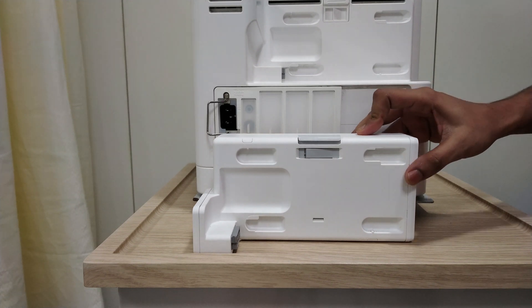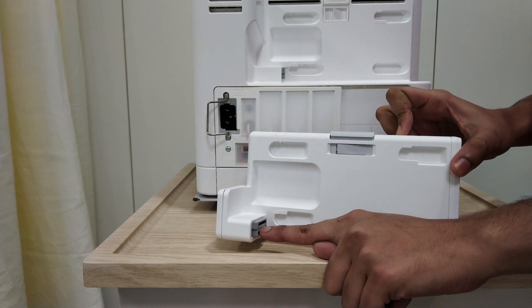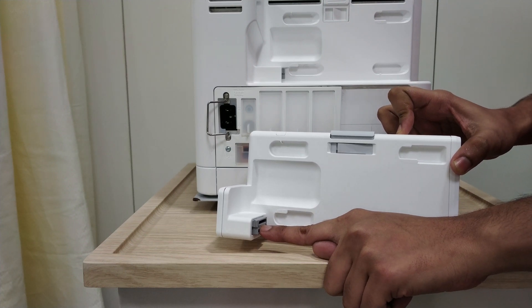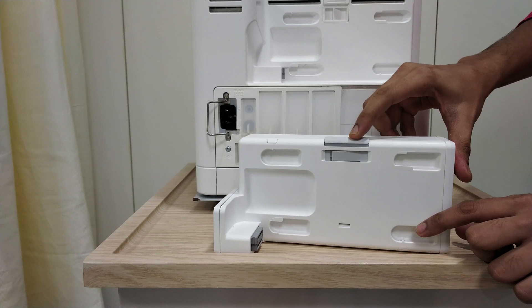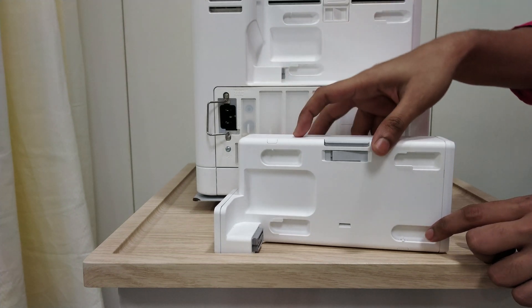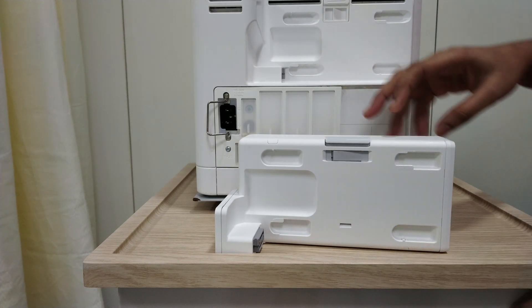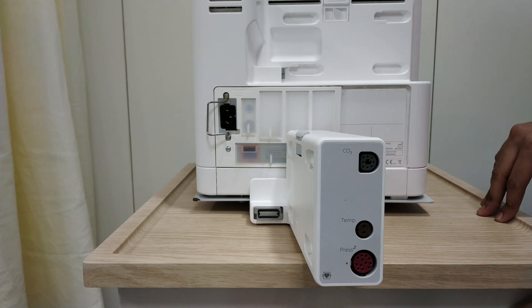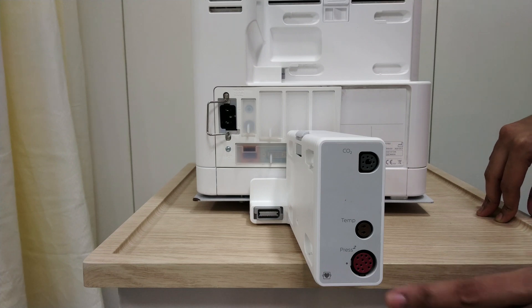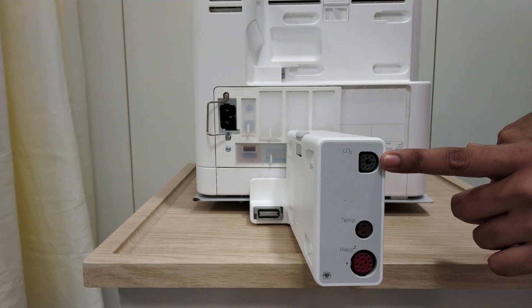This is the extension server. You can see the gray connector here where your MMS server — that is, your basic server — will get connected. There is also one gray button used to disconnect your basic MMS server from the extension server. There are many types of extension server. For example, this one has slots for pressure connection, temperature, and CO2 — specifically EtCO2.